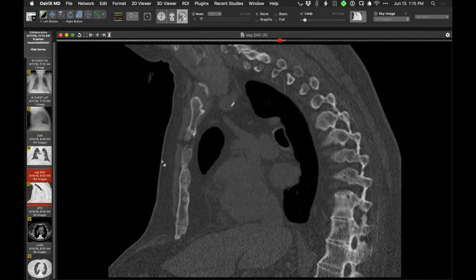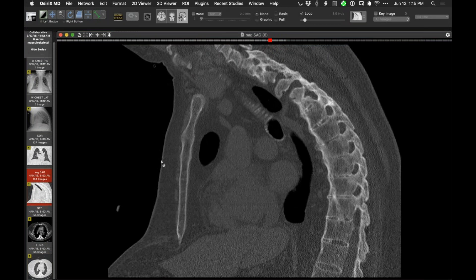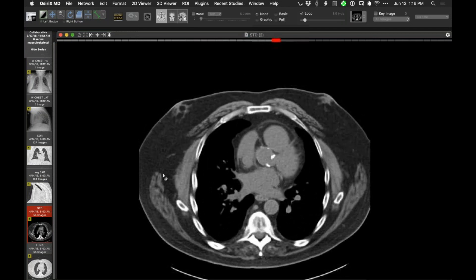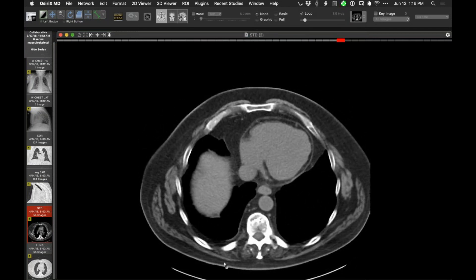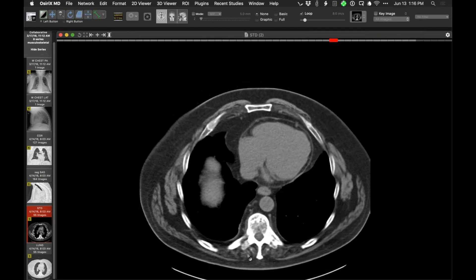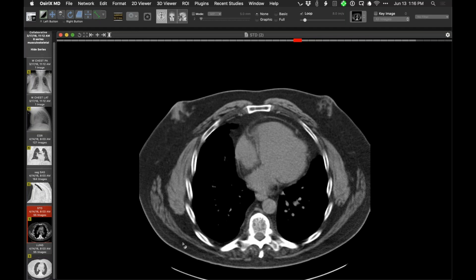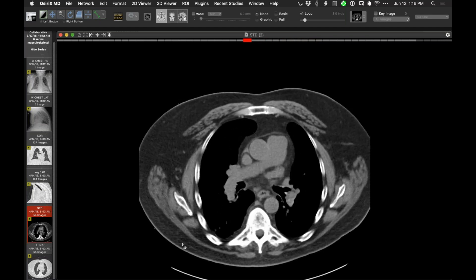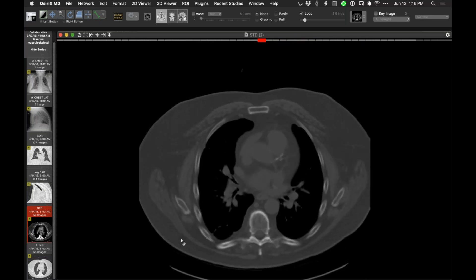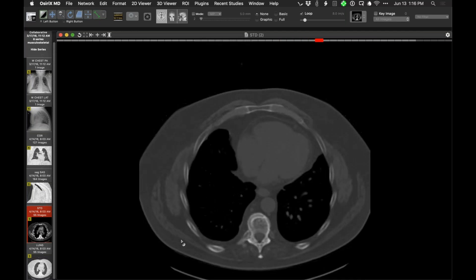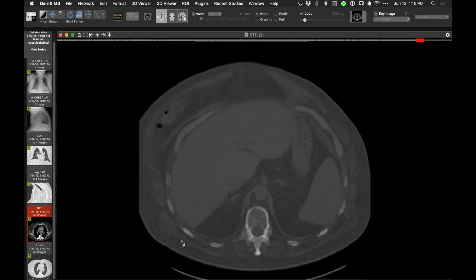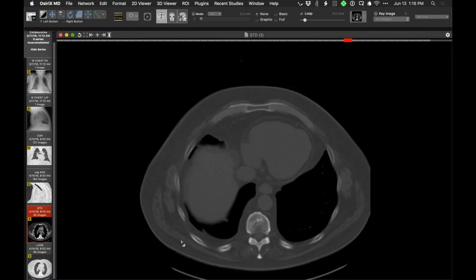On the sagittal images he has findings typical of ankylosing spondylitis — rather severe. In addition, his intercostal muscles appear atrophied, with some atrophy of paraspinal muscles as well. He undoubtedly has a restrictive ventilatory impairment as a consequence of ankylosing spondylitis and severe ankylosis of his costotransverse and costovertebral articulations. The explanation for his clinical presentation is not interstitial lung disease.